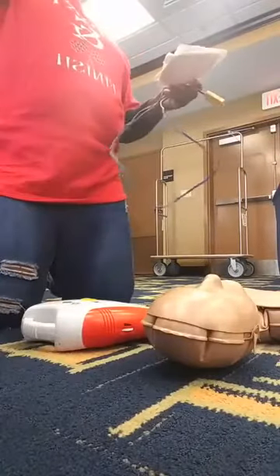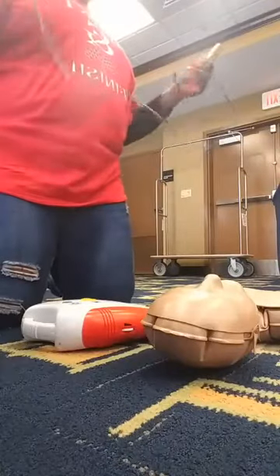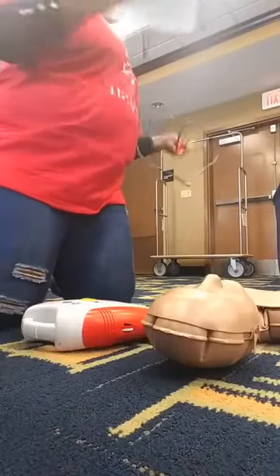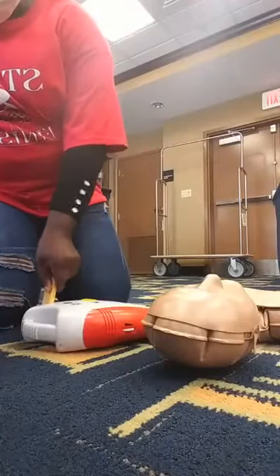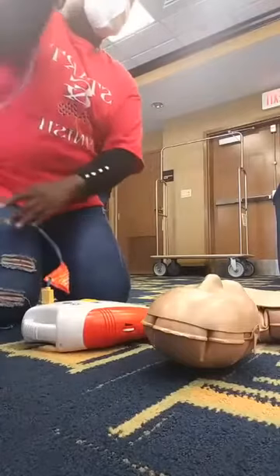So when the AED arrives, you want to go ahead and use it right away. We never want to delay using an AED. The sooner that someone can go and get the AED and bring it back, the better. You want to use it as soon as possible. Some AEDs turn on automatically. Some you have to physically turn on.